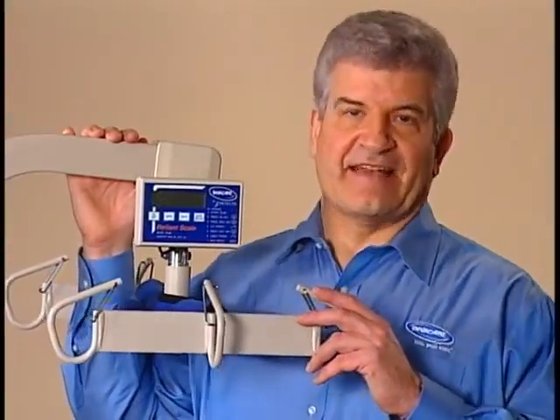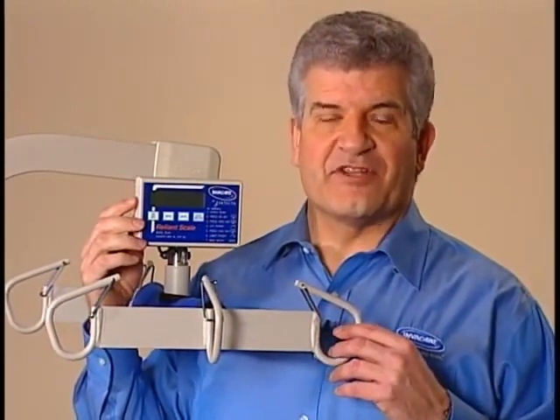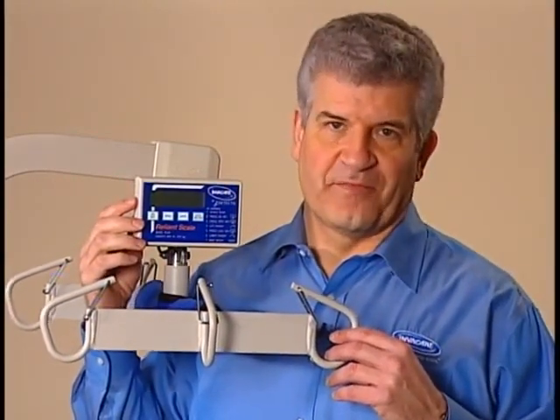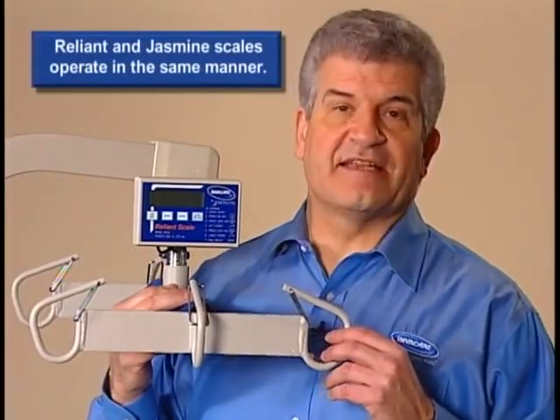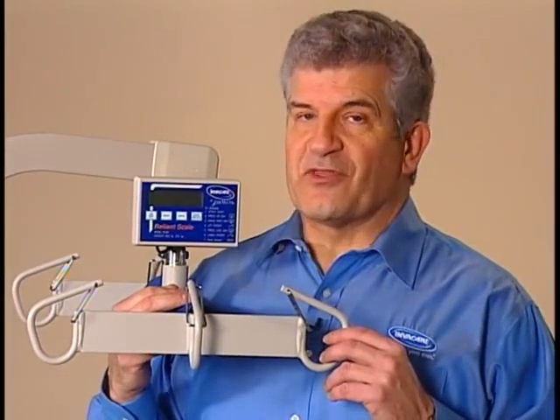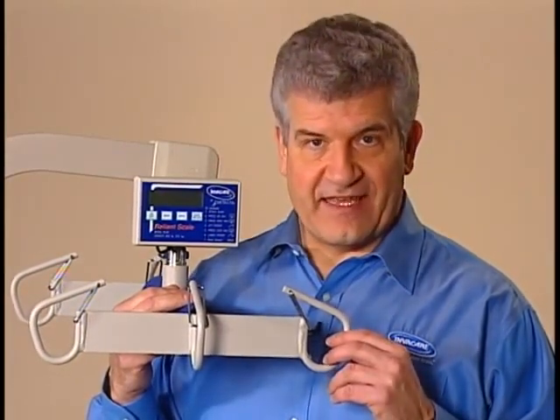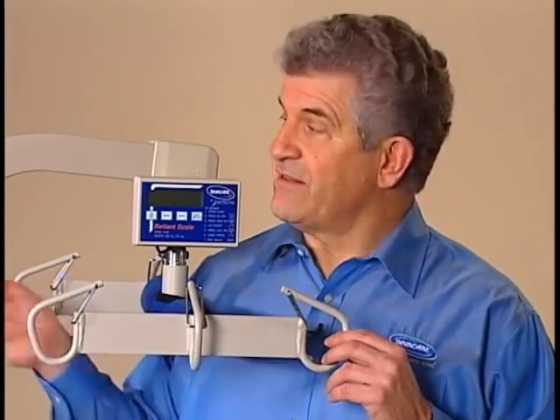You can minimize resident handling by using the optional digital scales to combine the transfer and weighing processes. The scale is mounted between the boom and the swivel bar. It can be set to display either pounds or kilograms, but keep in mind that the resident's weight must not exceed the lowest rated capacity of any component — the lift, the sling, or the scale.